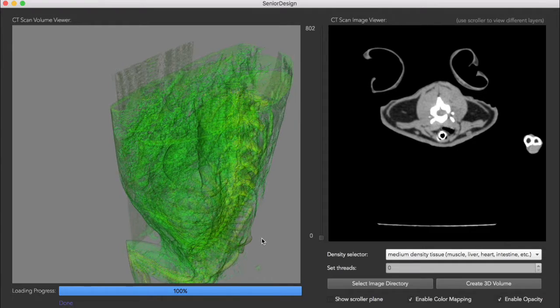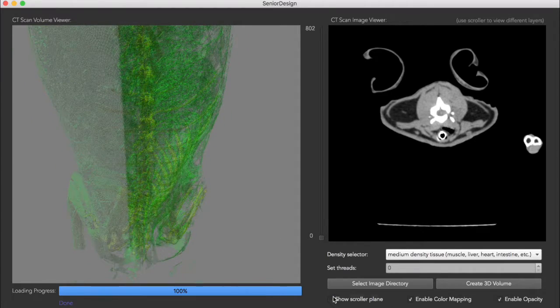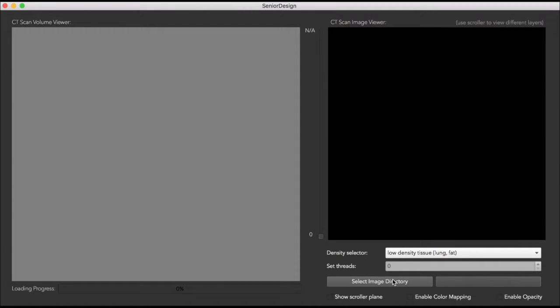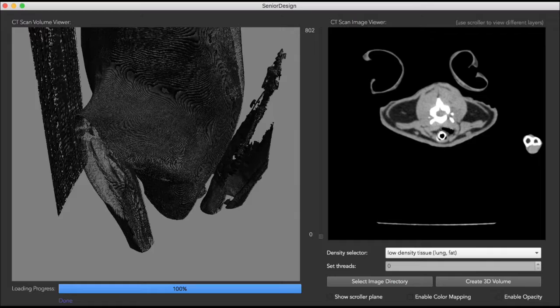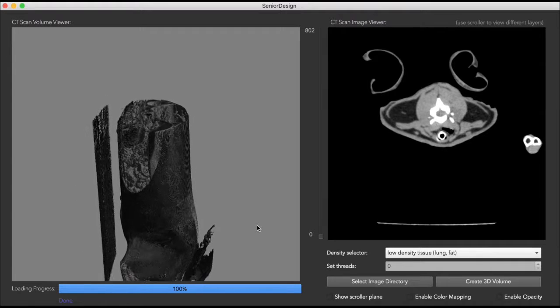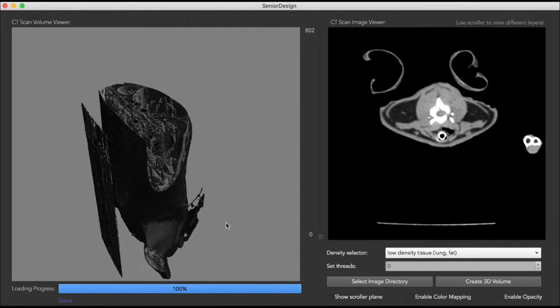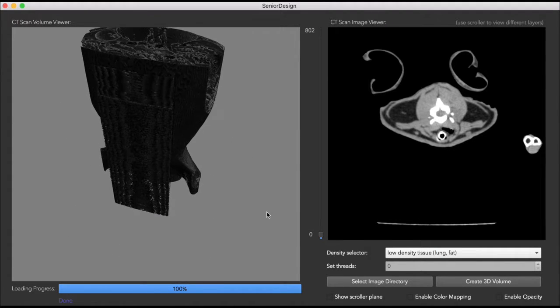I originally tried to fix this problem by multi-threading my application, which did have a big improvement. It went down to 20 minutes, but that still wasn't fast enough for me. On Adam's advice, I decided to convert my data structure from a map to a 1D array. So now 1D indices represent a 3D address, and I have a method of converting back and forth between the 3D address and the 1D address. Now, to load 801 rabbit layers takes 4.5 minutes. In the future, I would still like to be able to get this faster, but I'm very pleased with the progress from 45 minutes to 4.5 minutes that I made.